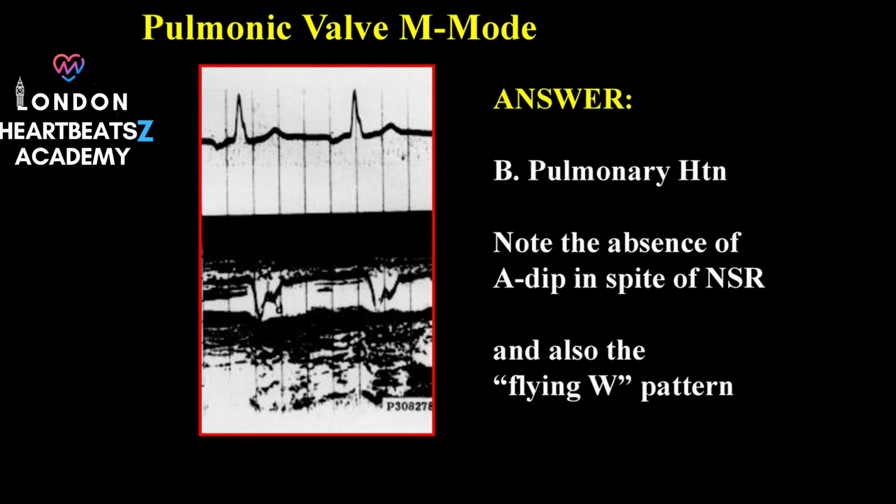Exactly. It's almost like the valve is sending a visual SOS signal. That's a great way to put it. It highlights how the physical forces within the heart can manifest as visual clues on the M-mode, providing valuable insights for diagnosis.